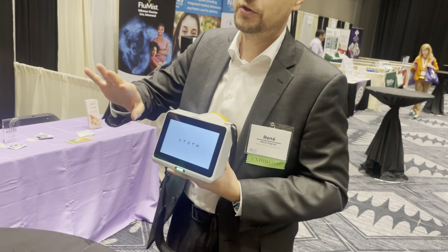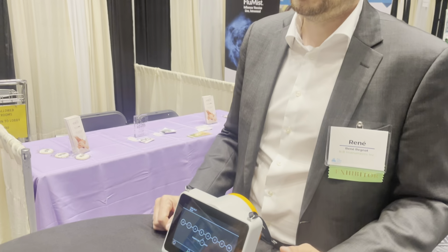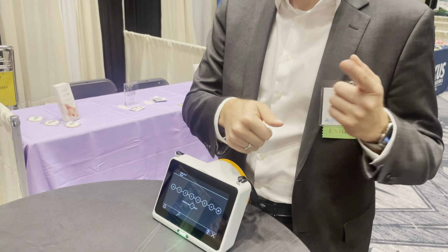Okay. The one in the middle, this is where the magic happens. This is our instrument-based vision screening. This is where we charge CPT code 99177. That's important. Okay, yes. We start with the age group.